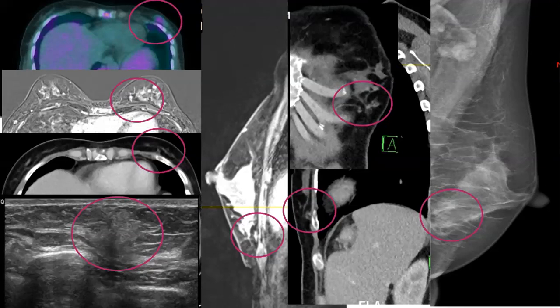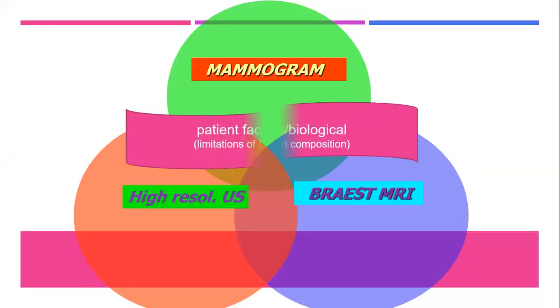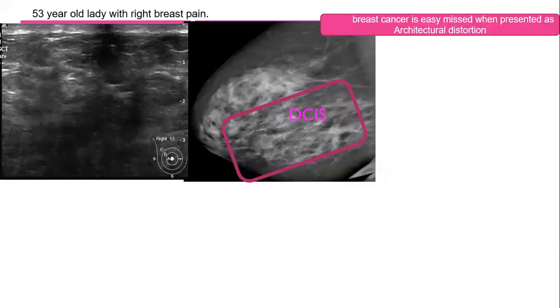That is why we approached the case in that way. Unfortunately, she's okay now with this, but even look at breast cancer, sometimes how aggressive it is. 1 centimeter, very tiny lesions giving extensive metastatic disease. Yes. Okay, so we discussed some of the patient-related factors. Let us go to other factors.